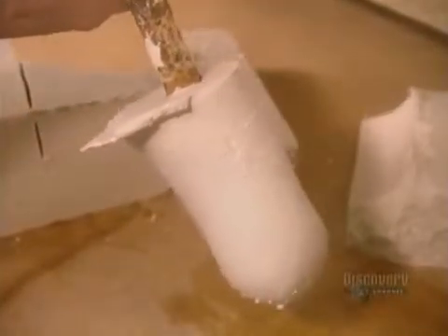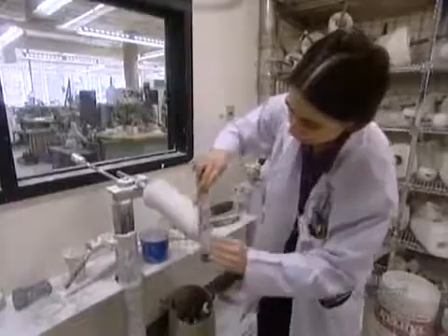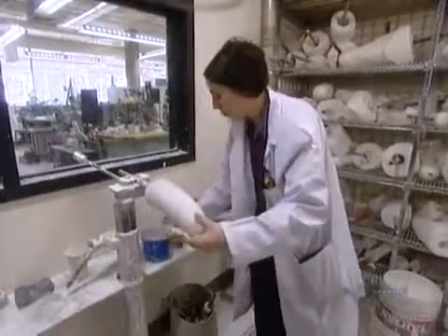Then, using sandpaper and files, they refine and smooth the surface. This plaster copy of the residual limb will now be used as a positive mold to cast the artificial limb.